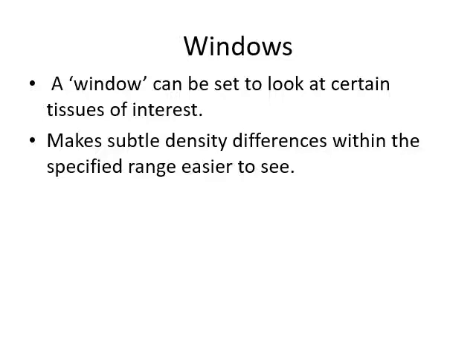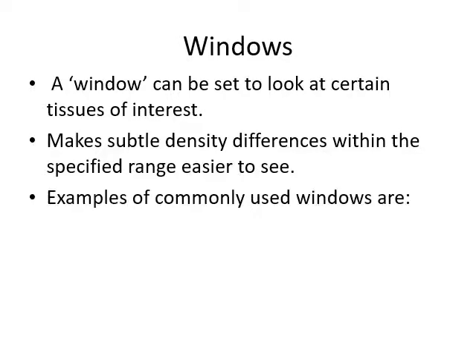All right, so usually we like a soft tissue window or a lung window or a bone window, and I'll show you the head ones, which are actually kind of cool. So soft tissue, lung, bone, again, subdural windows. All right, a lung window. Oh, a lung window's on there, so they use different types of windows.